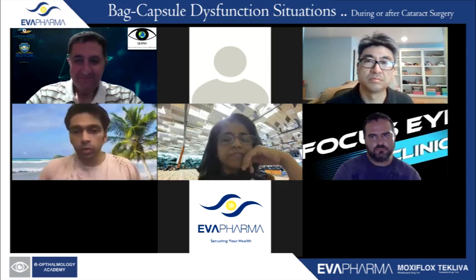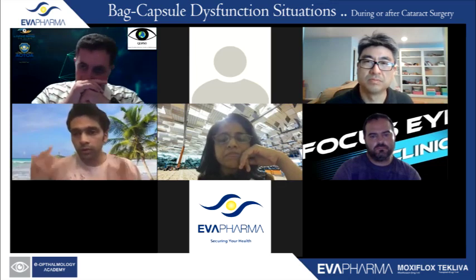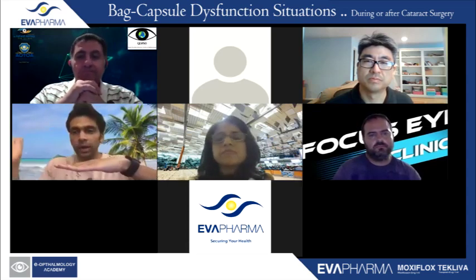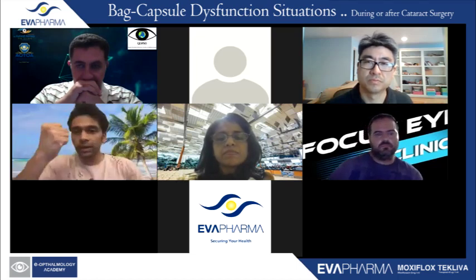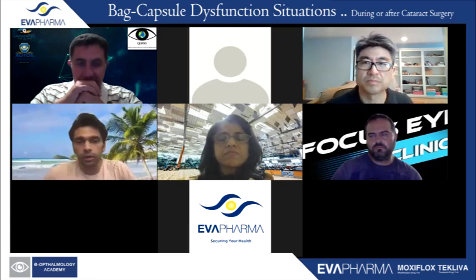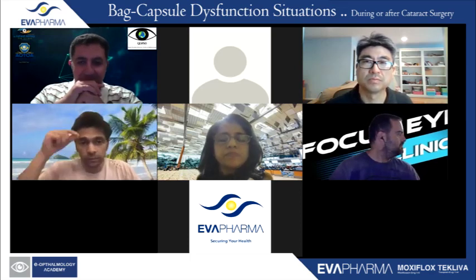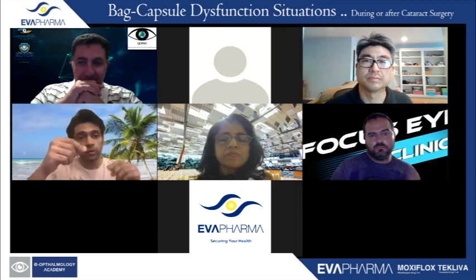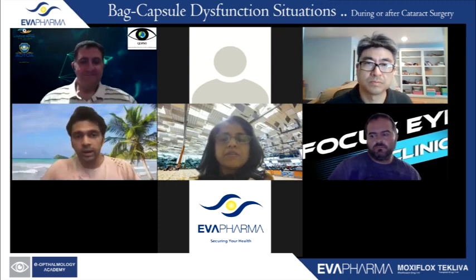I know Lukan would add that you can actually do PFCL and stuff. But at that point of time, the frustration level was so much that you can just use this extrusion cannula on top of the optic, where you're not even anywhere close to the retina, and just like a vacuum cleaner on a plate, it just sucks it up and holds it in place. You just bring it up, and it's very quick. So that's something that I would do. In fact, I've done so many of these cases now that you go lift these 3-piece lenses or even single-piece rigid lenses, bring them into the pupillary zone and glue them. You really don't even have to explant them anymore if they are undamaged.